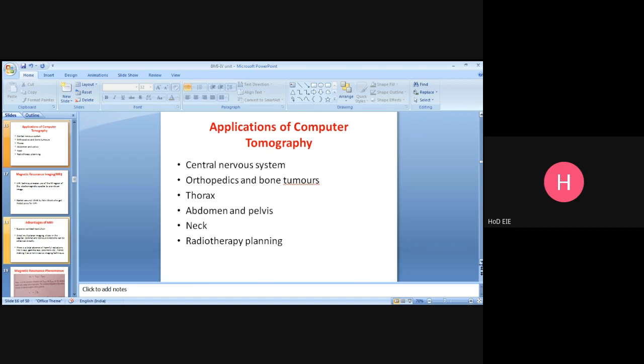Then coming to your radiotherapy planning, along with the routine treatment, you can also add this. Okay, that is the CT. That's the first stage that is involved, and here the image is transferred to the treatment planning. So it shows what are all the areas you have to mark out for this radiotherapy, as well as how much dose you have to distribute.